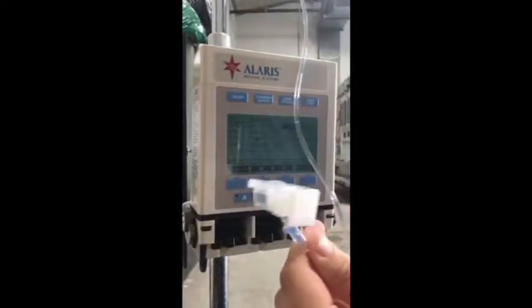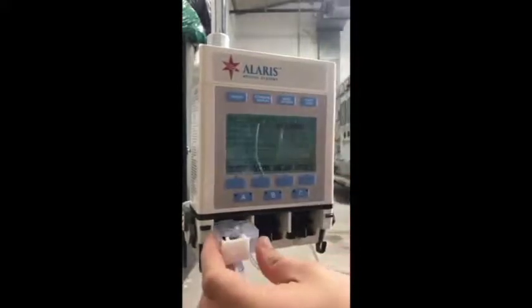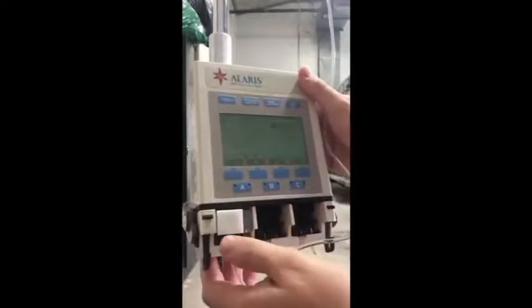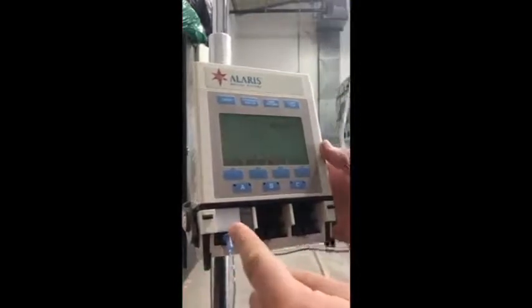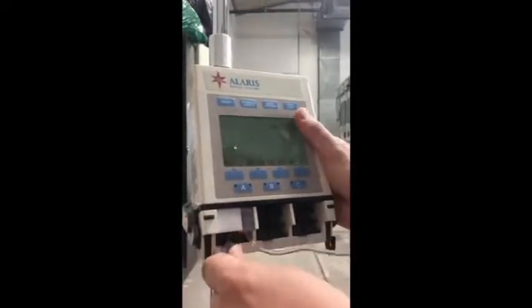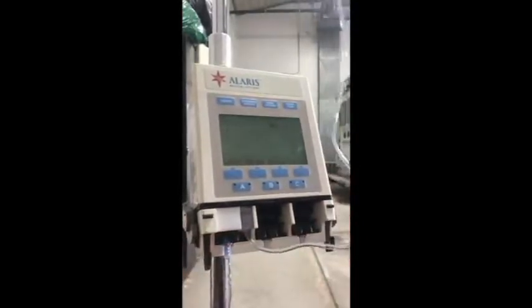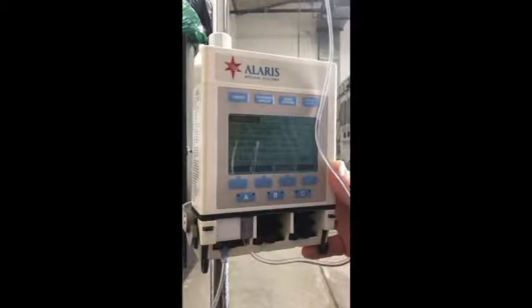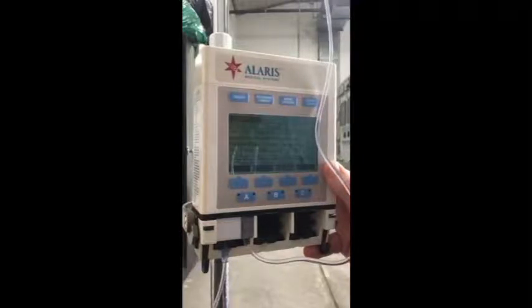We take the drip chamber upside down with it out and gently insert. Now once we get to this point, we have to pull down, pop it in, and you heard the 3 beeps. You're going to want to hear that. Check air sensor, verify tubing collar is seated properly below cassette. Clear any air in line manually or by clear air key, which is a 0.2 mL pulse.